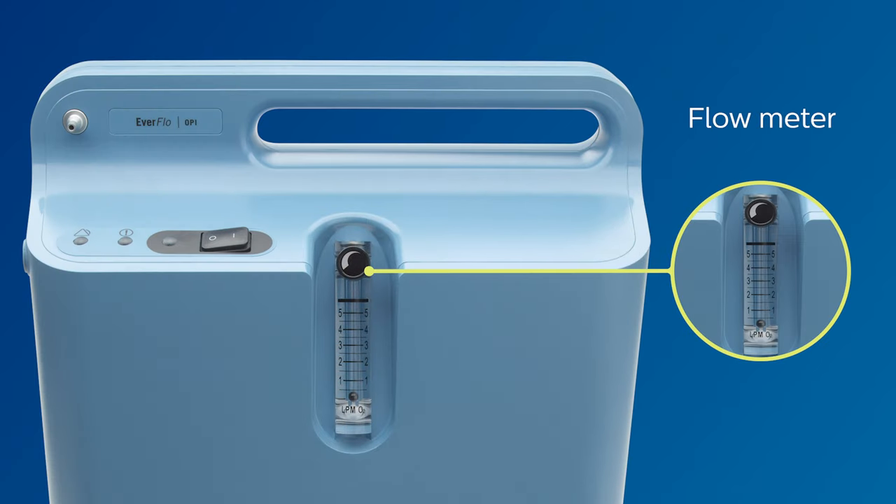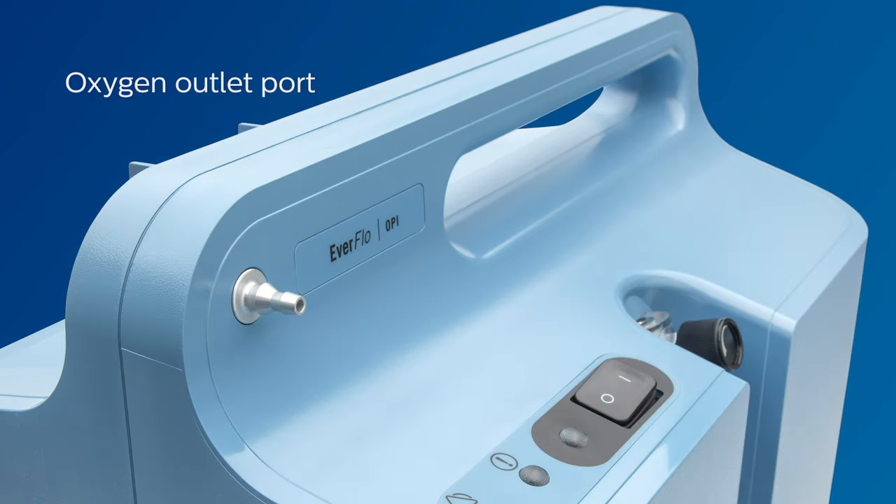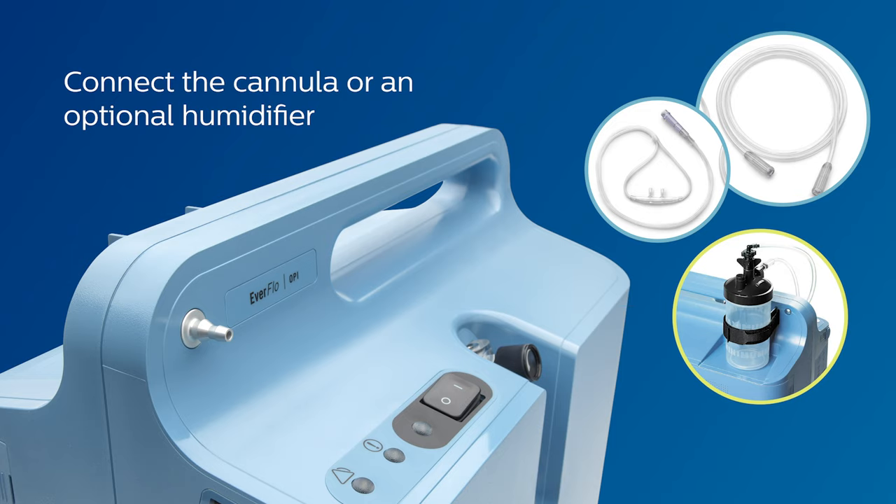This is where to adjust the flow rate to your prescribed setting. Next is the oxygen outlet port. This is where you can connect the cannula or an optional humidifier.